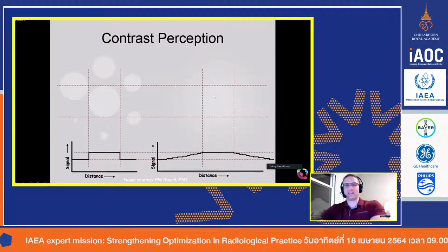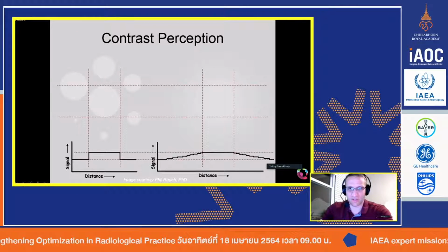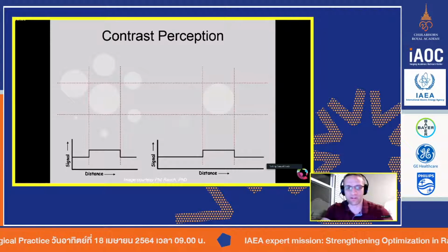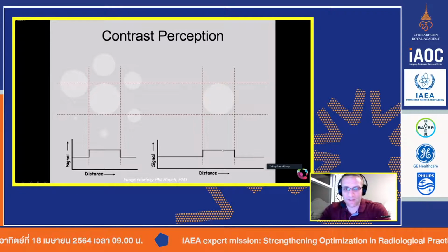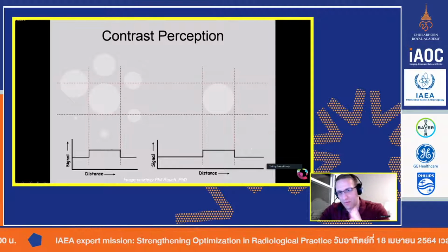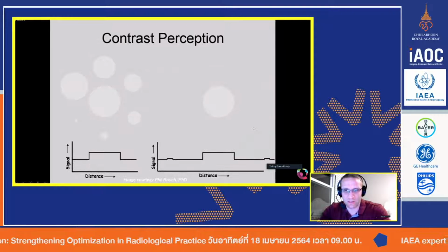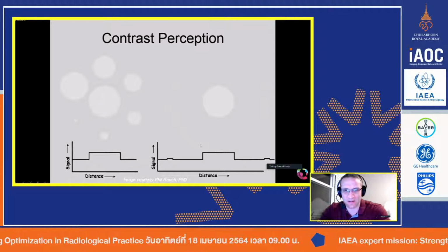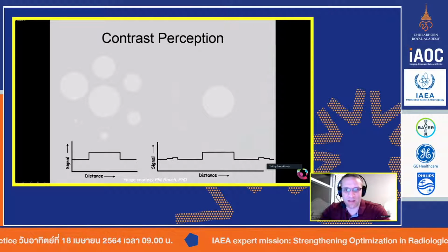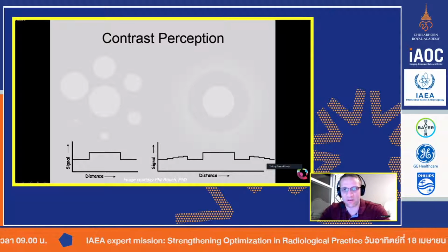Now, if you lean back from your monitor, you could probably see that there are a bunch of circles in this image. So I'm going to peel those circles off, all those annular rings. They're all gone now. So here you have a nice distinct edge against the background, same left, same right. Now I'm going to add a ring. You can maybe very faintly see it here, and you can see that I've added it on the plot. Now I'm going to add another one, and another one, and another one. So now you're seeing these rings as they're approaching.